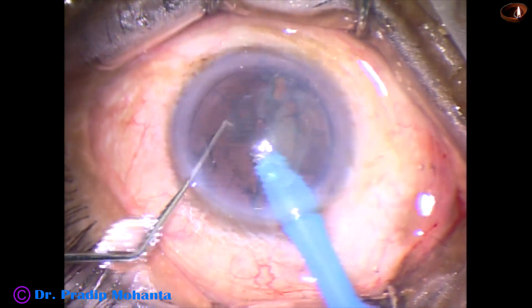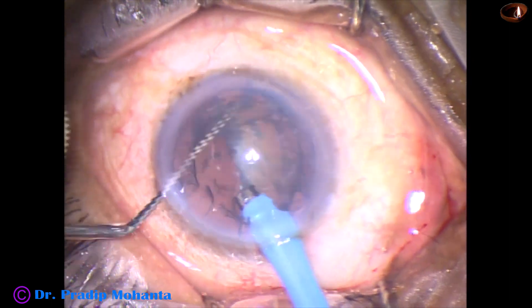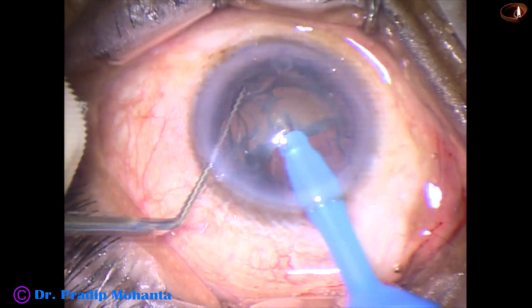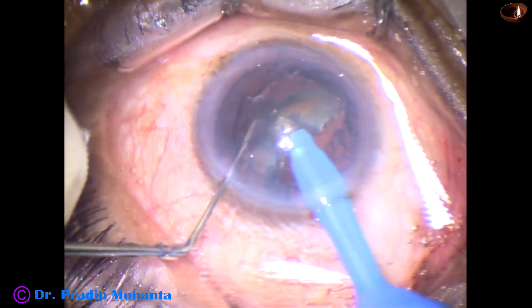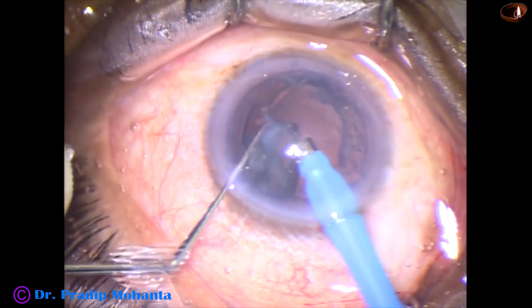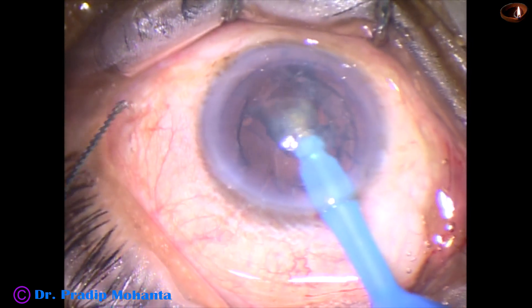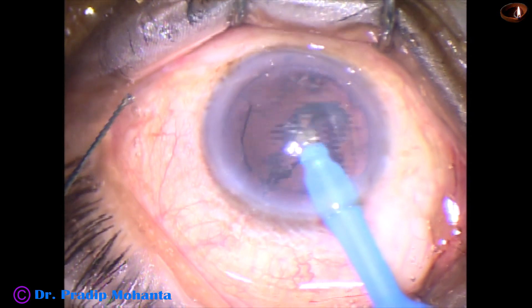Now, each nuclear fragment is emulsified. The settings in this case are 60, 40, 400 — that is 60% ultrasonic energy, 40 ml per minute flow rate, and 400 mmHg vacuum.